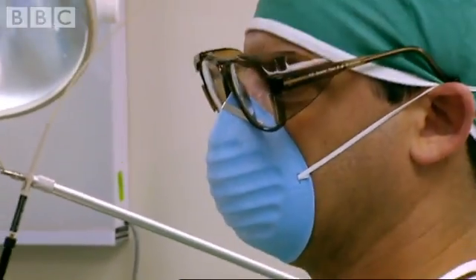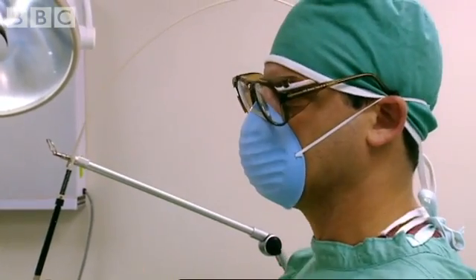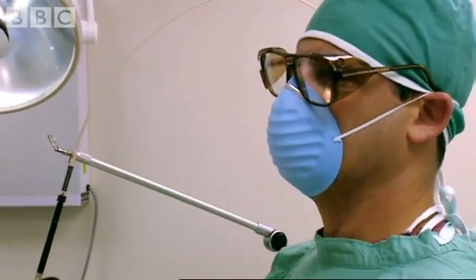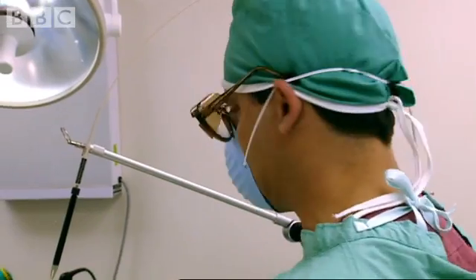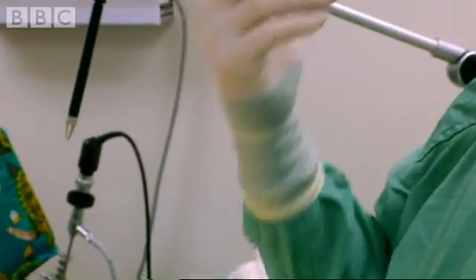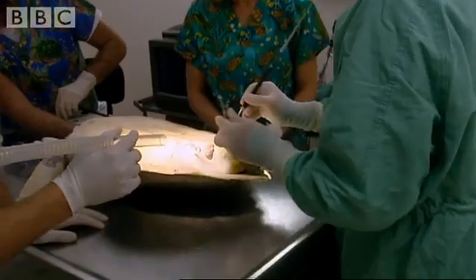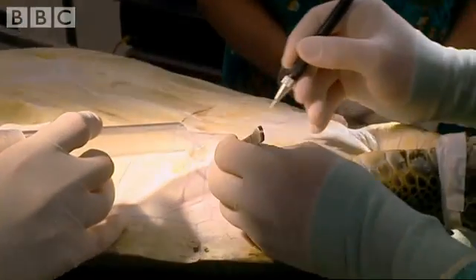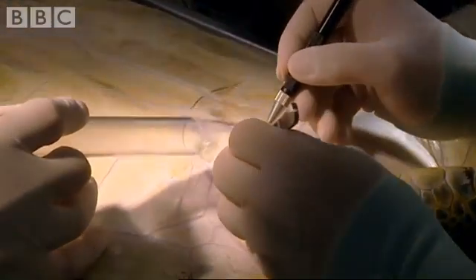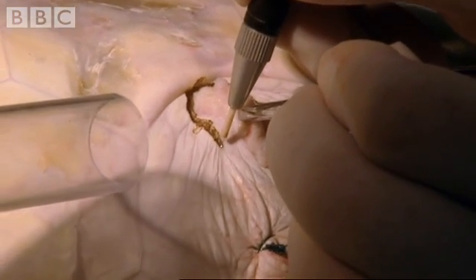You won't see a red beam. The wavelength of this laser is above visible light, so it's beyond what your eyes and my eyes can see, but it's still there. That's why we're wearing protective goggles — because if the laser were to hit a sharp scalpel blade and reflect off, it could still hit your eye and damage your eye. The glasses will protect your face. You can see it cutting, but you can't see the laser itself. Not at all. That's amazing.